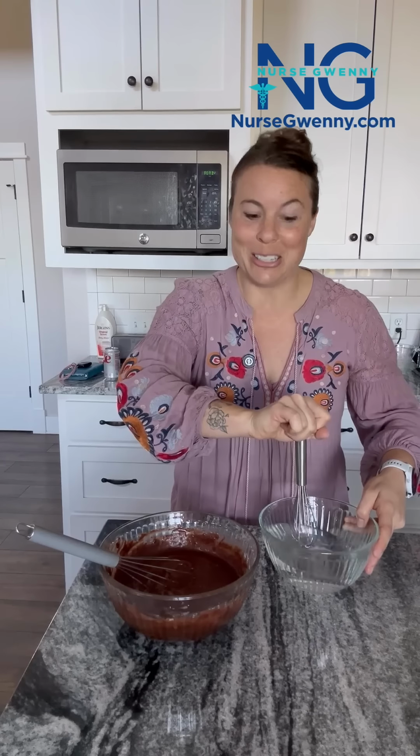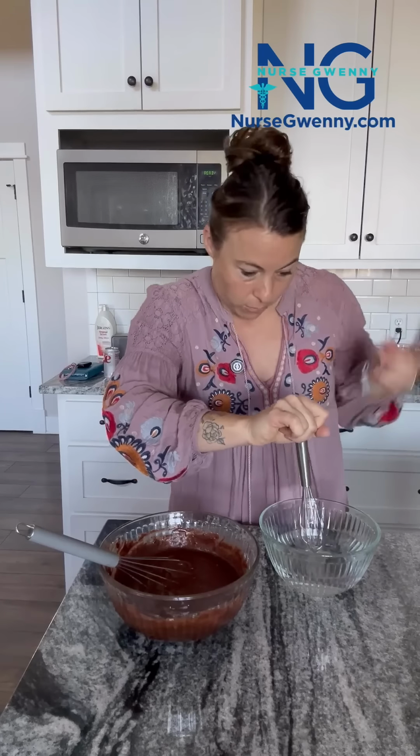And then the machine, here I'm gonna have to hold it like this, the machine moves the bowl a little bit. And see, with this water, I sloshed it around everywhere, about got it in my brownie mix. As I move the bowl, because the water isn't very strong, it's not a viscous solution. This would be early in the test. We put the blood in there and it's still liquid. When they slosh it around, it doesn't move the little joystick rod thing that they've got in there.